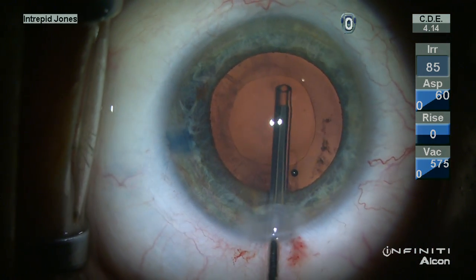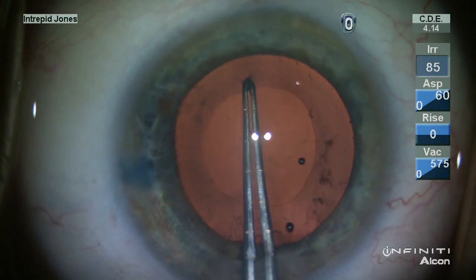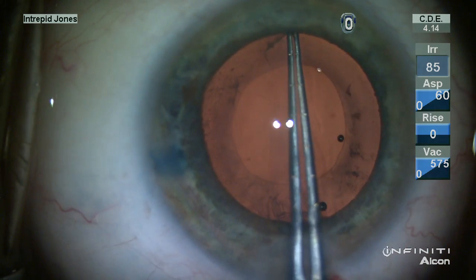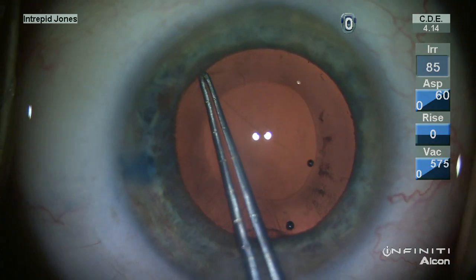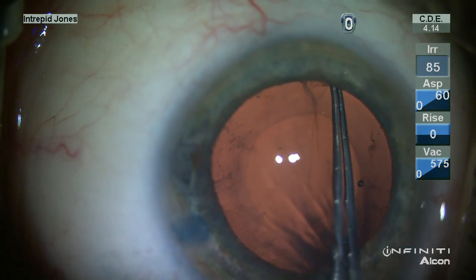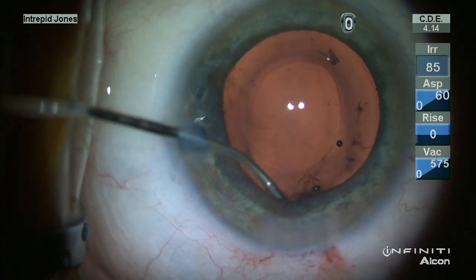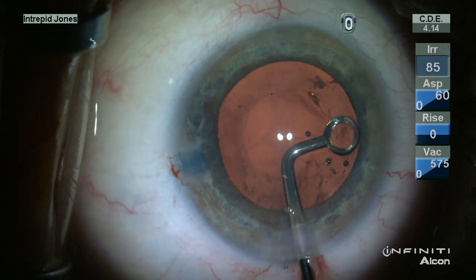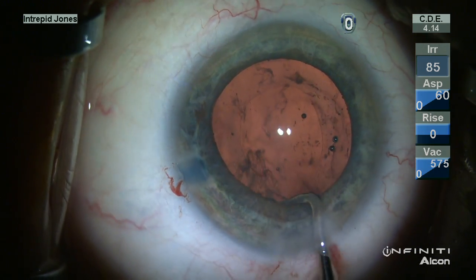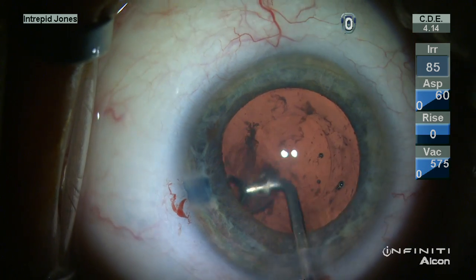The posterior capsule is polished centrally using a Terry squeegee and there is significant plaque material nasally. Under viscoelastic to create better tension on the posterior capsule, the edge is elevated and then Utrata forceps are used to peel this membrane off the surface of the posterior capsule. Although peeling of this membrane is not mandatory, it does help to provide a clearer capsule and therefore delay opacification of the posterior capsule as thoroughly as possible. This curettage of the undersurface of the anterior capsule rim and the peripheral capsule bag helps liberate significant material, especially in the sub-incisional region.